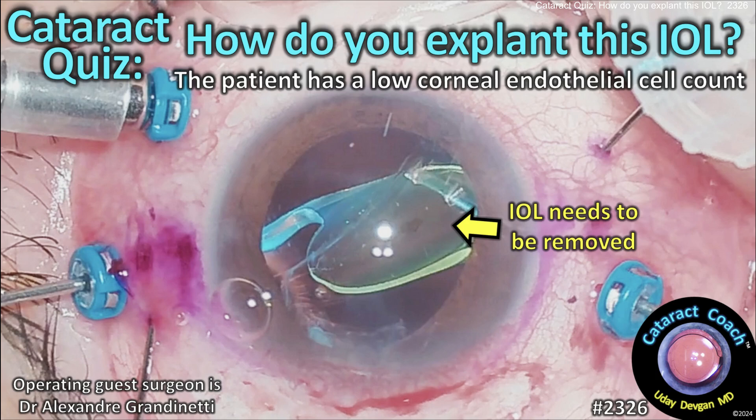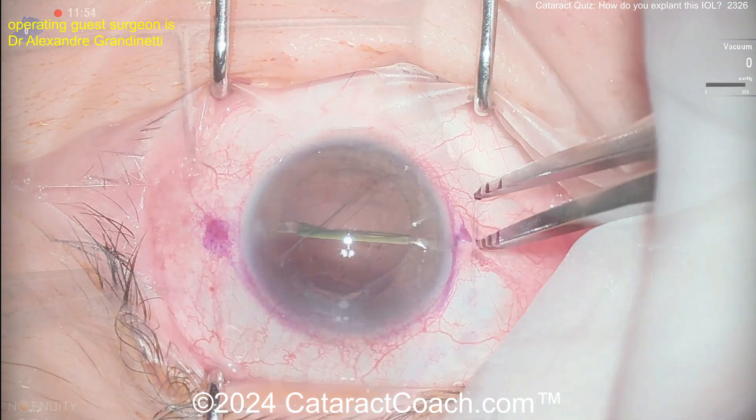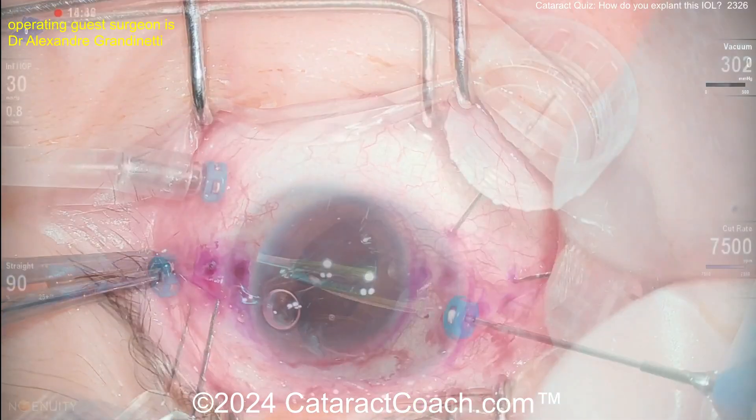Cataract quiz from cataractcoach.com: how do you explant this IOL? The patient has a low corneal endothelial cell count. Here you can see a single-piece acrylic lens that is obviously dislocated and needs to be removed from the eye.